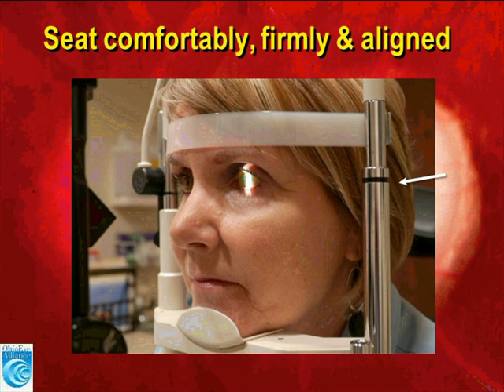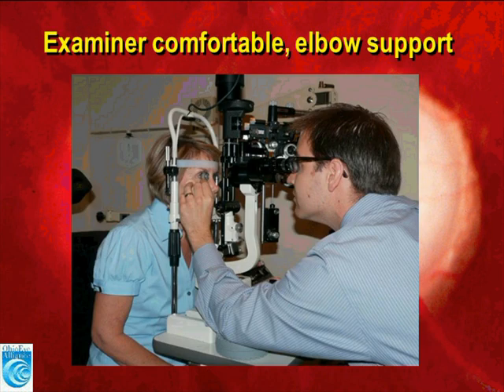It's important for the patient to be seated comfortably with their chin in the chin rest, forehead against the strap, and you will notice on most slit lamps there is a bar to the right or left with a black line. That black line is for alignment of the lateral canthus. If you have the patient's lateral canthus aligned with this black line, you will almost always have adequate excursion up and down in order to be able to achieve full gonioscopy in all mirrors. It's important for the examiner to be comfortable.